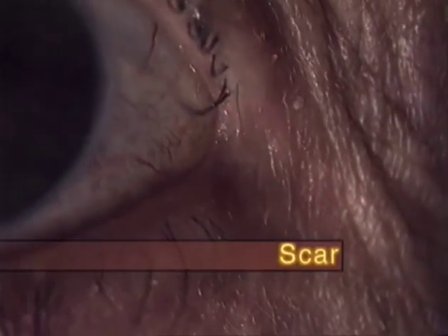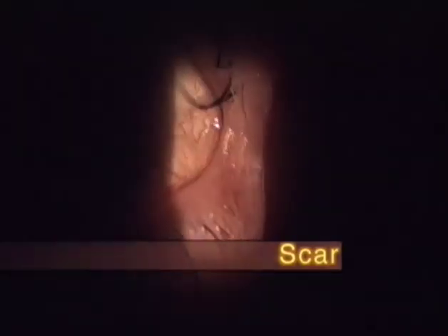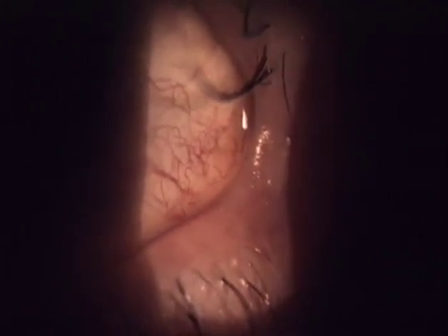In this second case, the obtuse angle at the lateral canthus has been caused by shrinkage of the lid skin, and the resulting incomplete lid closure has induced corneal damage as shown by this scar.